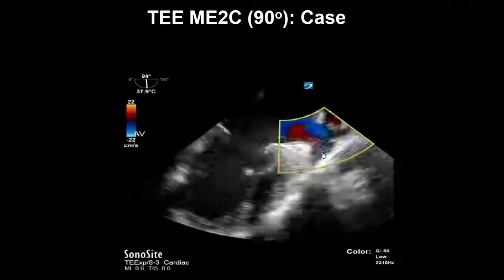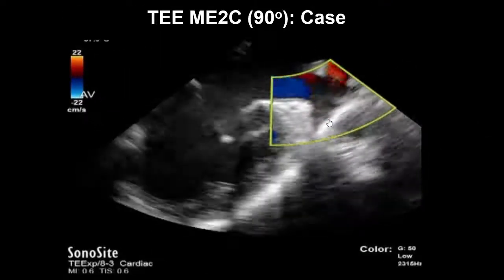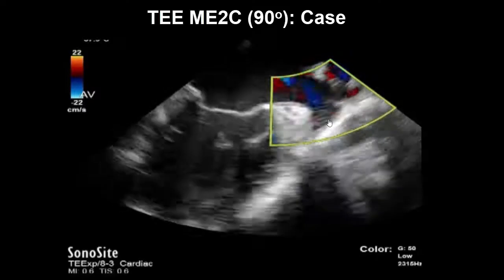We will then hone in and zoom in on the left atrial appendage with the zoom function, and we see here that there's an echogenic mass within the left atrial appendage, which looks like clot, and there's some echogenic stranding as well on this mass. With the gain turned slightly up from our previous views, we now see more evidence of smoke indicating a low flow state.